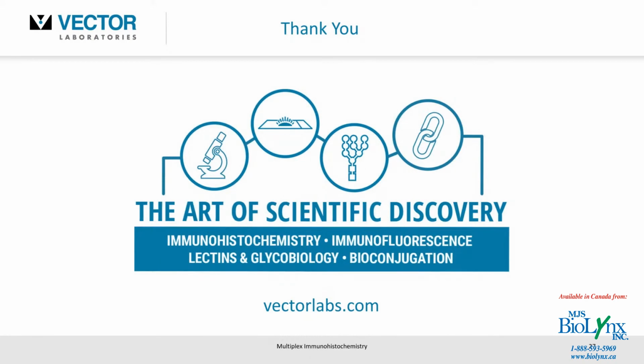So the concern with applying the Duet kit on rodent tissue would be the potential of that anti-mouse secondary antibody cross-reacting either with, say, mouse IgG that might be inherent in the tissue, or rat IgG, another commonly used lab rodent species as well. And that would generate false positive results. So that's why I would hesitate recommending the use of the Impress Duet on rodent tissue.